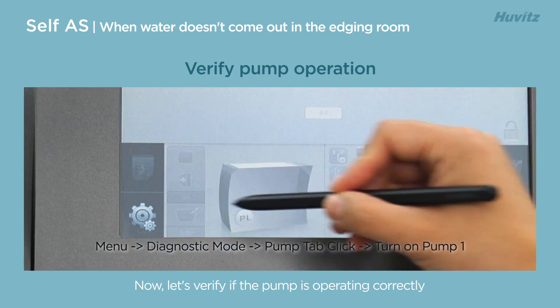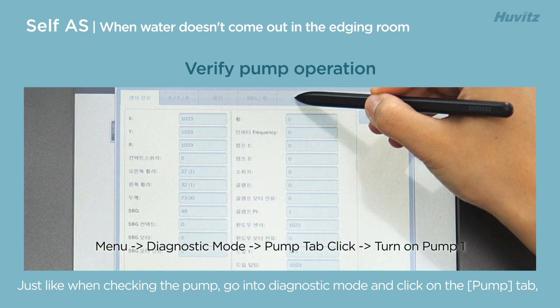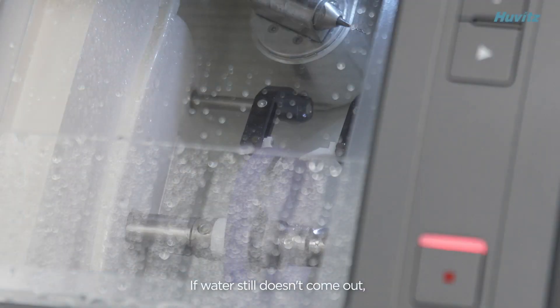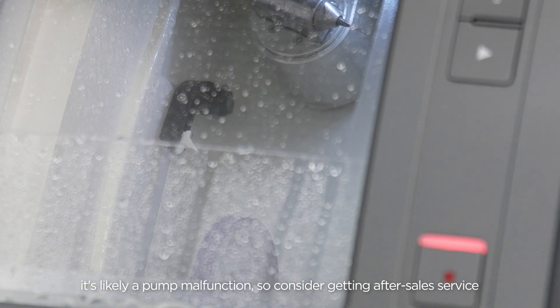Now let's verify if the pump is operating correctly. Just like when checking the pump, go into diagnostic mode and click on the pump tab, then click on pump 1. If water still doesn't come out, it's likely a pump malfunction, so consider getting after-sales service.